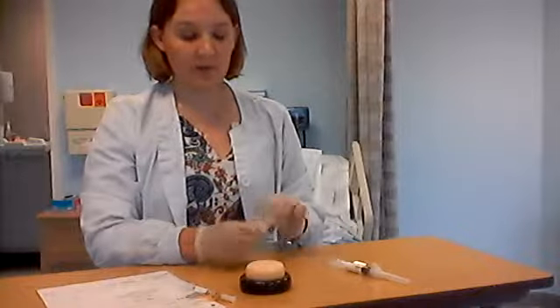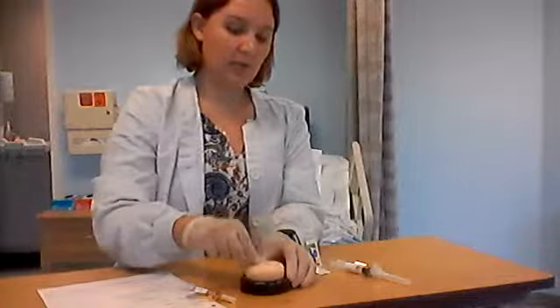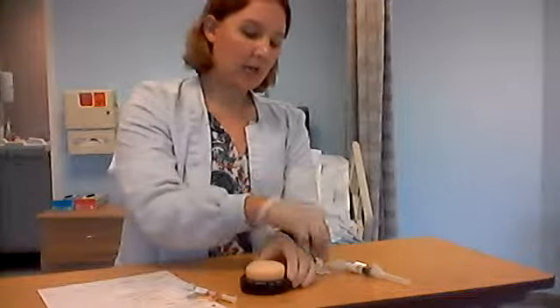You're going to assess your site. You're looking for redness, bumps, bruises, irritation, scar tissue. We're not using that site if it has any of those. Okay, we clean our site in a circular motion. You do not blow on it to dry it. You do not fan it to dry it. That's just spreading germs.